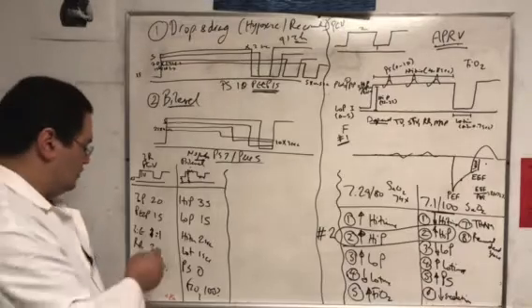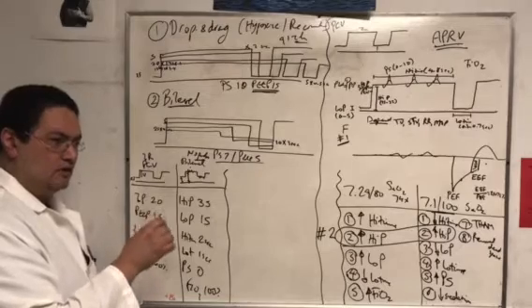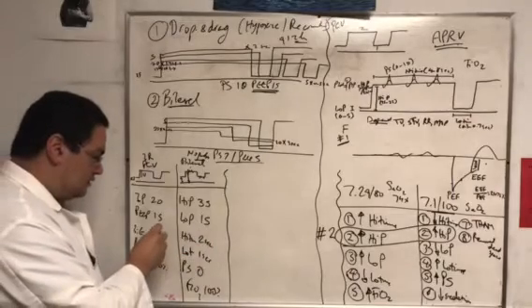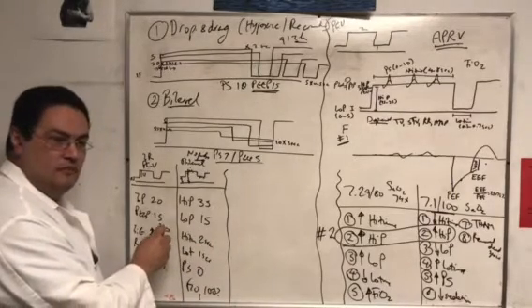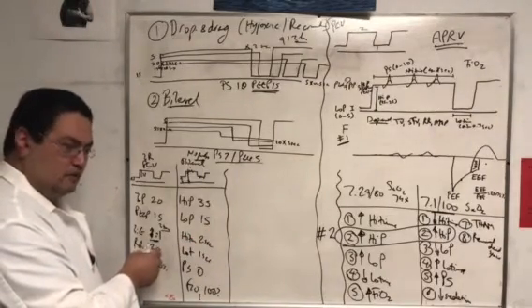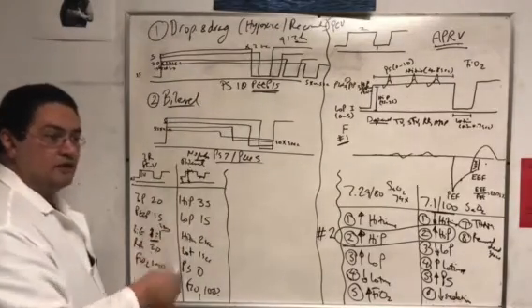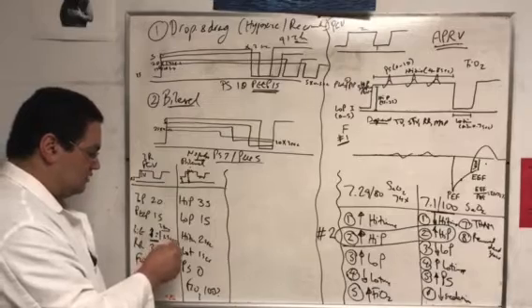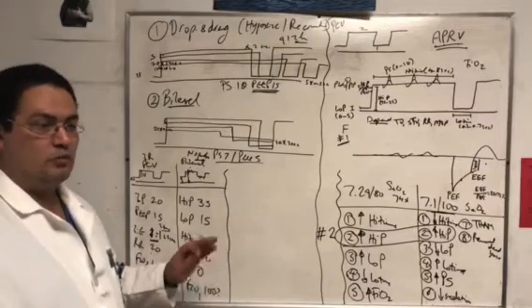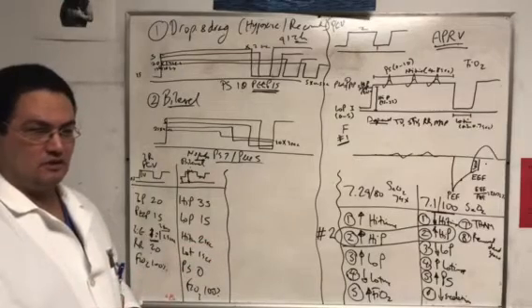When you order 1-to-1 I-to-E ratio for pressure control, is there a button on the vent that says I-to-E ratio? No. The button on the vent that the respiratory therapist sets is called the I time. So they do exactly the same calculation. They say, okay, he wants 20 breaths per minute, the patient is breathing at the same rate, let's say, and 1-to-1 I-to-E ratio, so it's 1.5 seconds for inhalation. I'm gonna assume that the exhalation is also gonna be 1.5 seconds. No problem. What does the patient do as soon as he wakes up, when he stops the sedation?